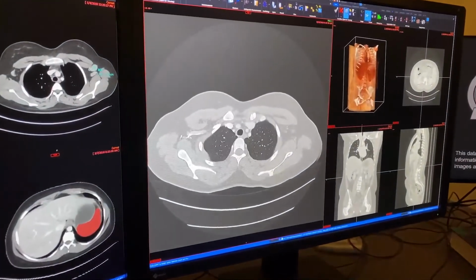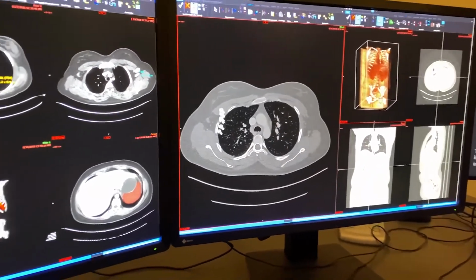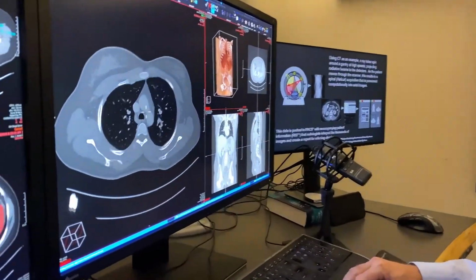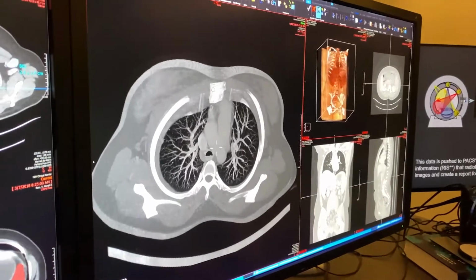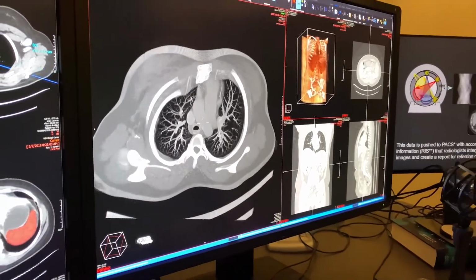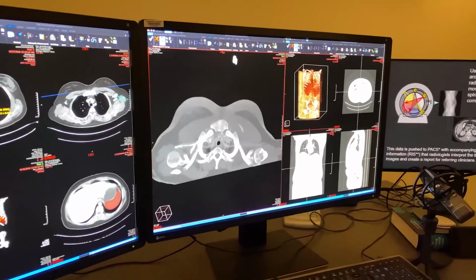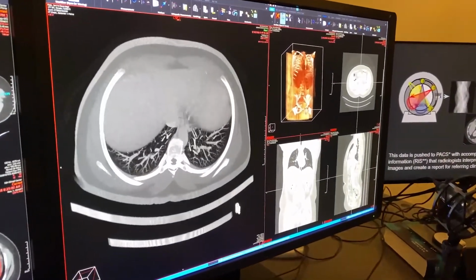the ribs, and so the ribs are kind of in section here, so I go to a multiplanar. You're going to see these come back, but if you focus on this one window, then I can tilt this to the ribs. So now I'm tilting along the ribs. I can put them in the thick mode. Since they have a little bit of lateral curvature, I'm going to tilt them more in plane like this. And I'll bring this back.